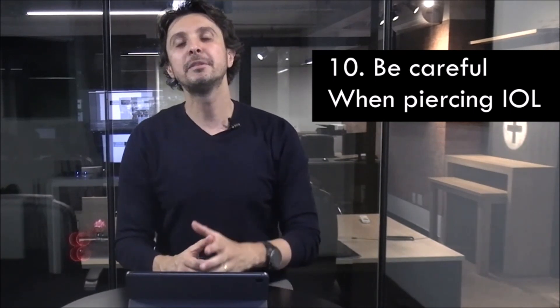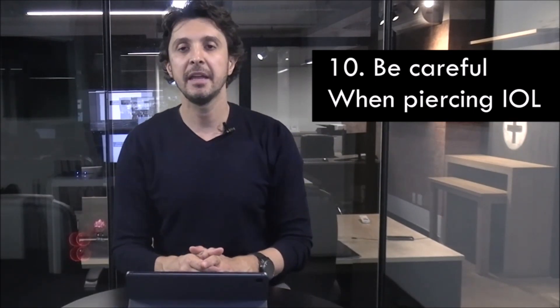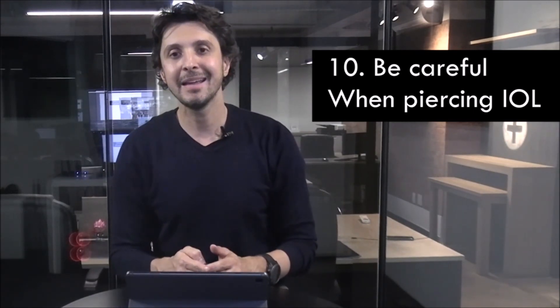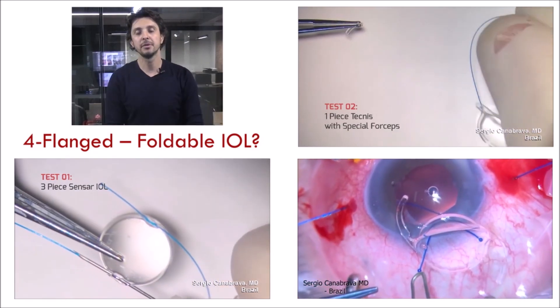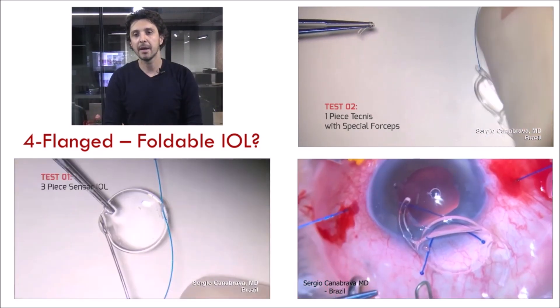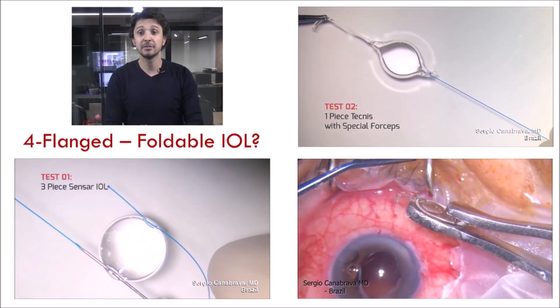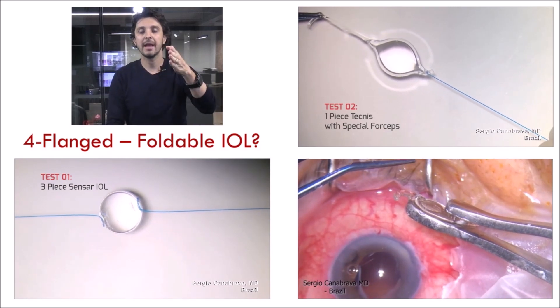I was the first surgeon to discuss the piercing IOL technique when I presented it at the AAO and on iTube, but after my research I had some problems with tilt. After that I started to use foldable IOLs with four loops — there are many options with four-loop IOLs — and you can see these three videos showing tests I did with a horizontal axis, vertical axis, and IOL placement. Thank you, it was a pleasure to be here with this first special video for iTube after joining the iTube editorial board. It's a great honor for me.